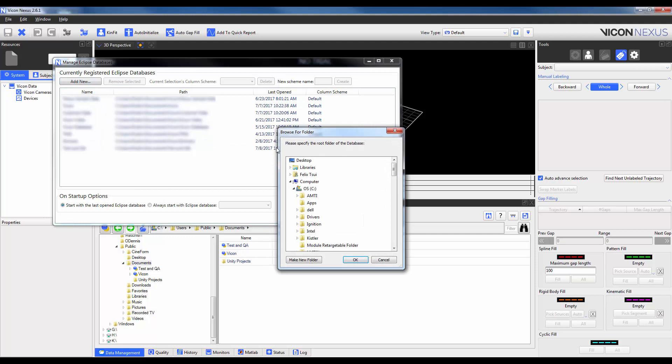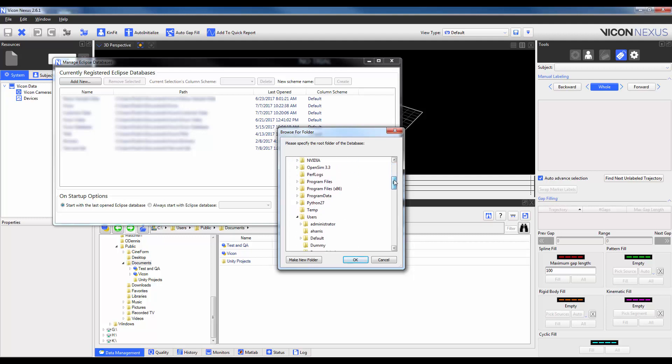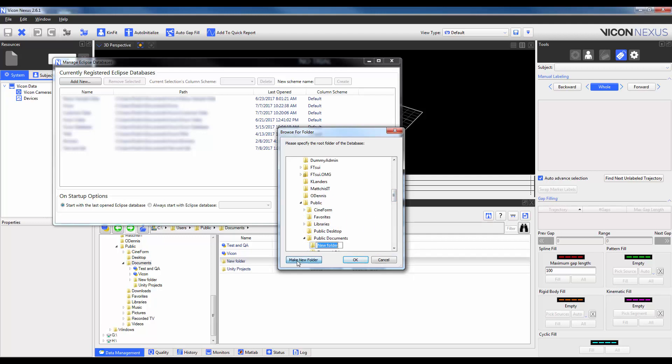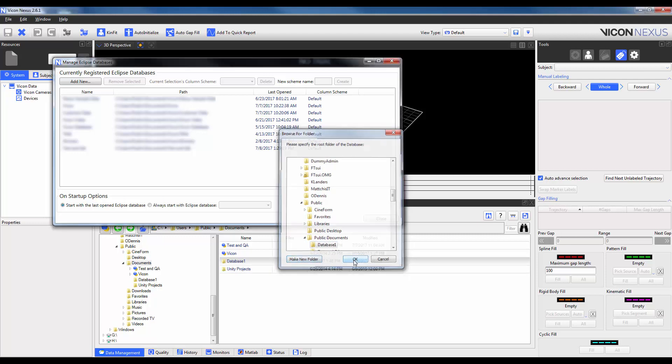Click Add New and then navigate to the folder in which you would like your database to be stored. While you could choose any folder within any drive, you will want to select a folder which has the proper read-write privileges across user accounts. An example of one such folder is the Public Documents folder. Once in the correct folder, I will select Make New Folder and give my database a name, in this case Database 1. I'll go ahead and click OK.